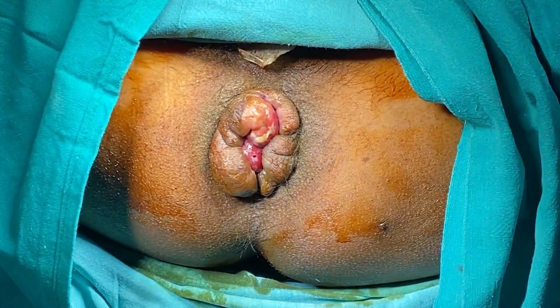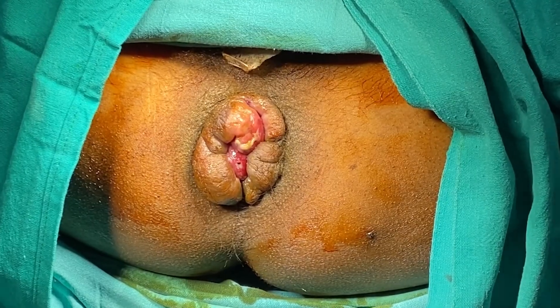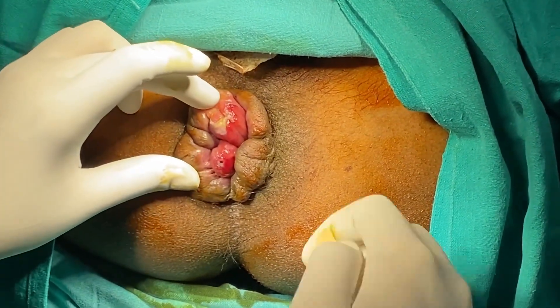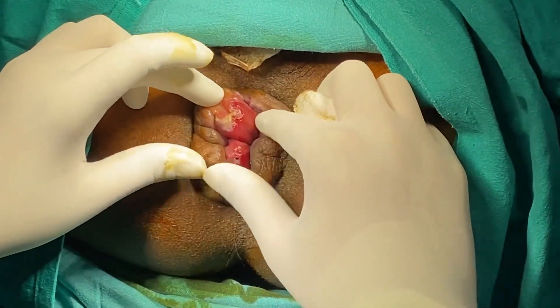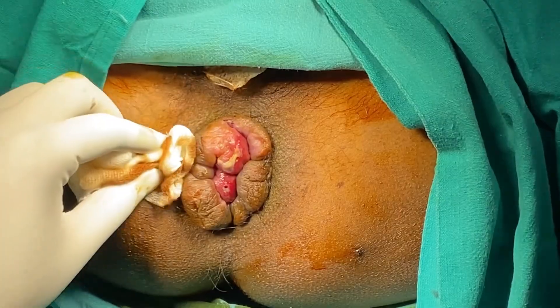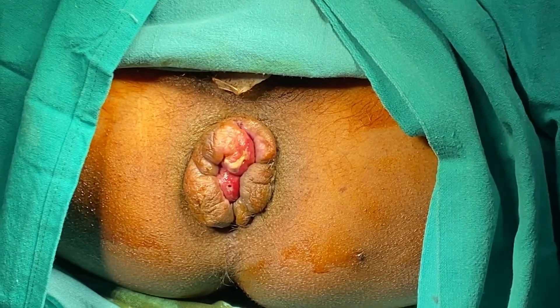This is Dr. Vikran. This is the case of a grade 4 hemorrhoids with edematous skin tag. One can see the collapsed piles all around. I am planning to do a stapler procedure. Before that, I am going to inject.